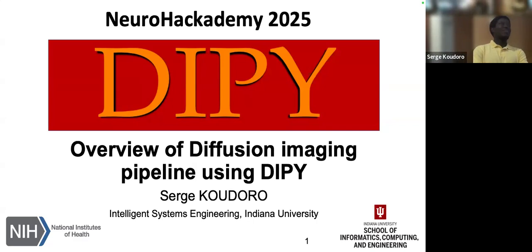Take it away. Yeah. So thank you, Ariel, for this nice introduction. Today I will make a quick overview of a diffusion imaging pipeline using DiPy. I don't know how many of you are familiar with diffusion, so please raise your hand if you know what diffusion imaging is or if you are used to it. Oh, great. Okay. So a big part of the audience. That's good. So I might be able to go deeper into some concepts. I will see during the presentation.